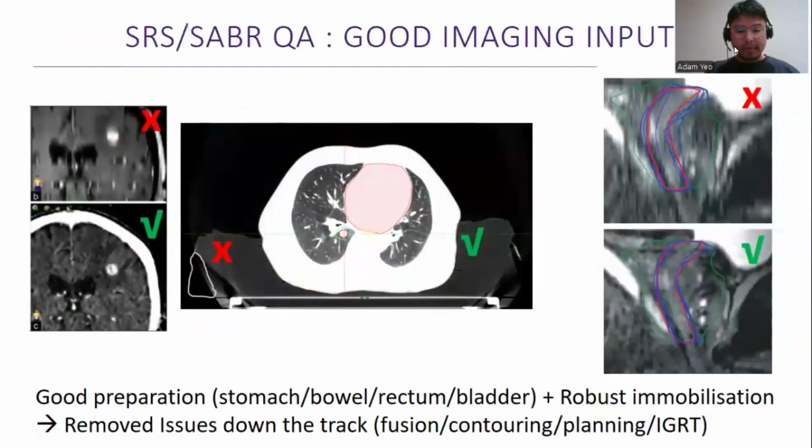So once the patient preparation and image acquisition are done, the image handling is very important because our PTV margin is now close to our slice thickness. This is a good example of a single image. The vac bag is well included here, because even with an extended field of view, some of the vac bag may be chopped off and not included in the field of view, which needs to be dealt with correctly, such as avoiding the beam entry here.